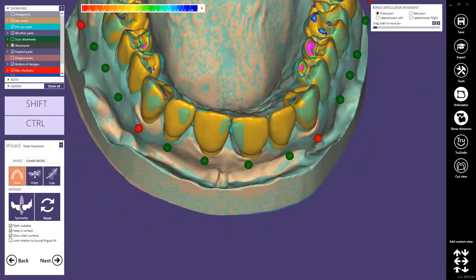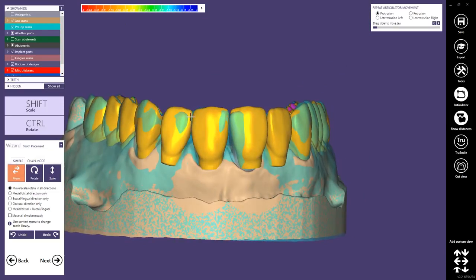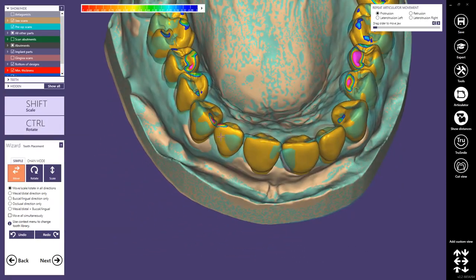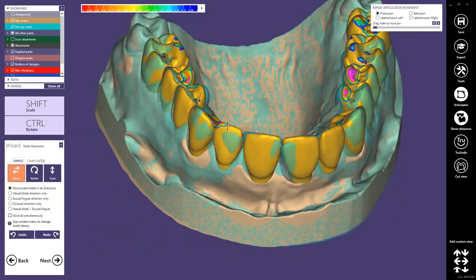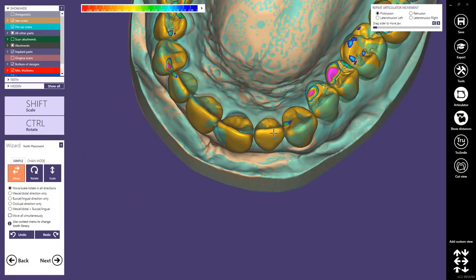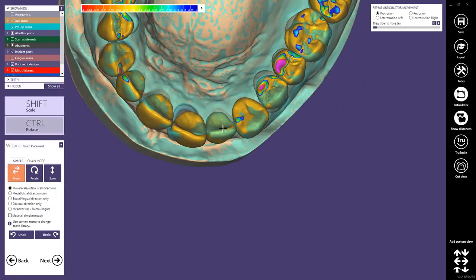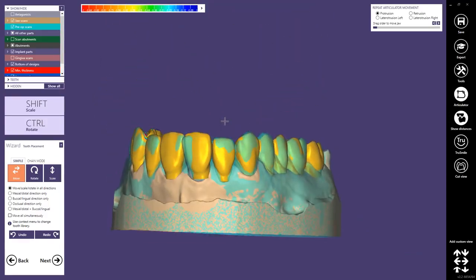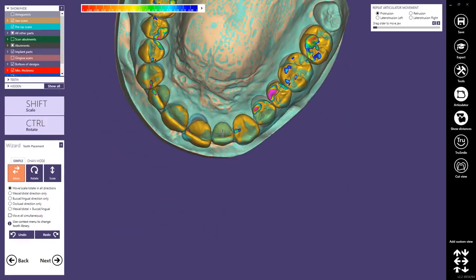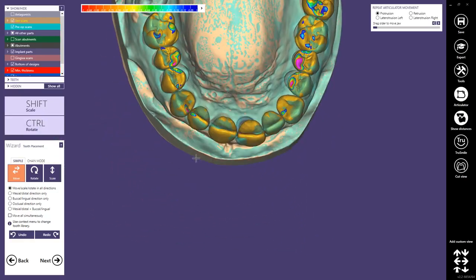Yeah, usually I just use the chain mode for a rough placement, and then I proceed with the simple mode, and then I do fine tweaking on my placement. You can invest some time in this placement, as it is important for the anteriors, for the bridge of the anteriors. The posteriors are not so important here, because they will serve only later as visualization or a reference when designing the partial.